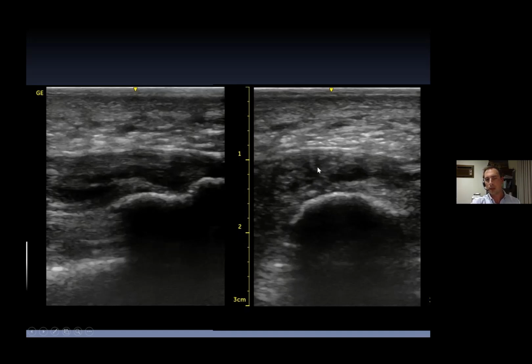When I look at an ultrasound like this, with this sort of patient I really change my expectations, particularly if they've got pain that's quite severe. These are the sort of acute on chronic presentations that you'll see, where they've gone from having heel pain for 6 months that's been relatively stable, and then all of a sudden it's deteriorated. And you'll often find when I ultrasound them, this sort of thing. Because we've got some tearing there, there's nothing for the shockwave to act on in this area.